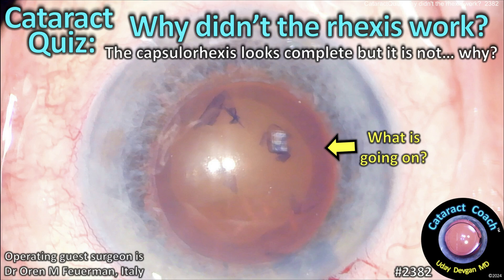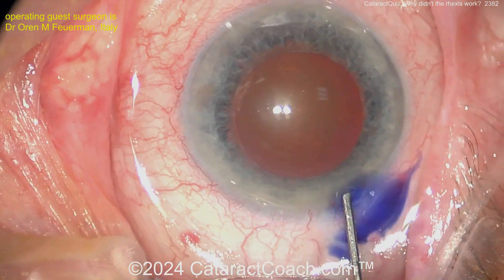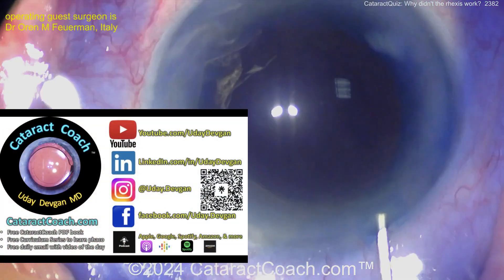Cataractcoach.com cataract quiz: why didn't the capsulorrhexis work? It looks complete, but it's really not. Let's show you this case — starting off looking like a routine case here, some trypan blue dye.